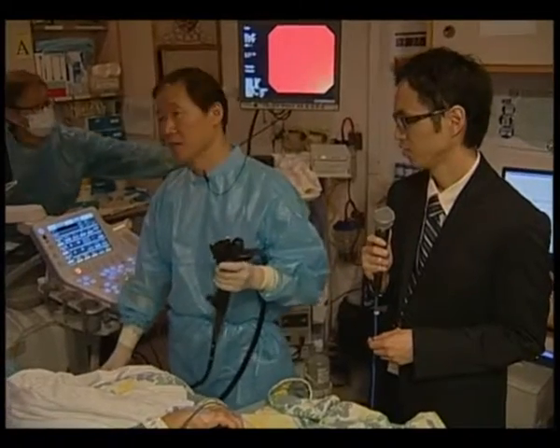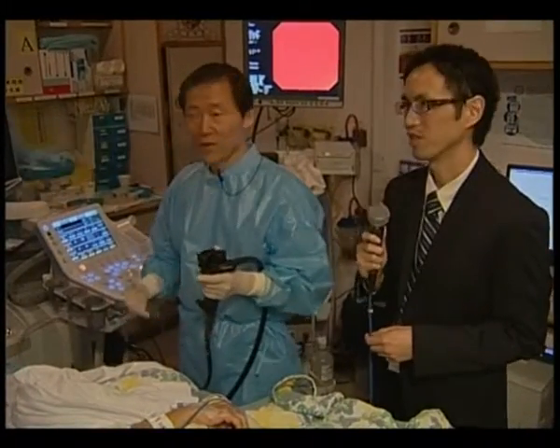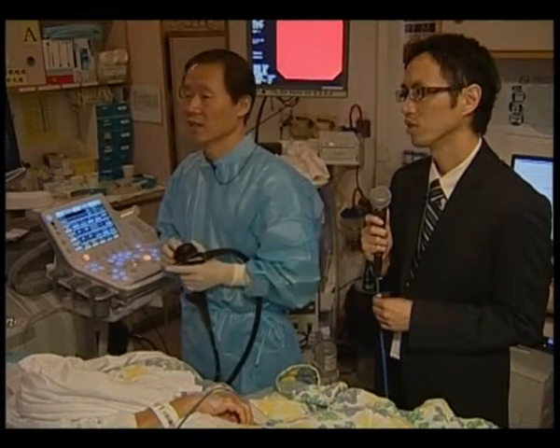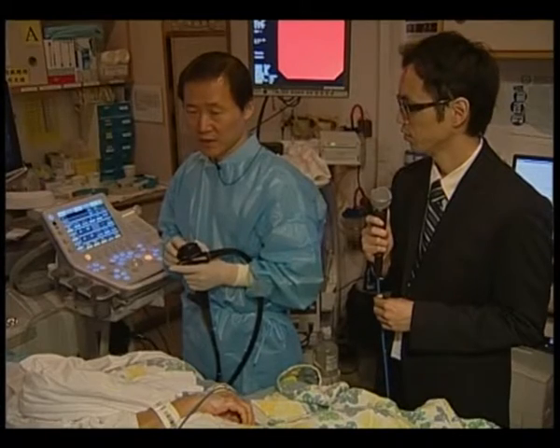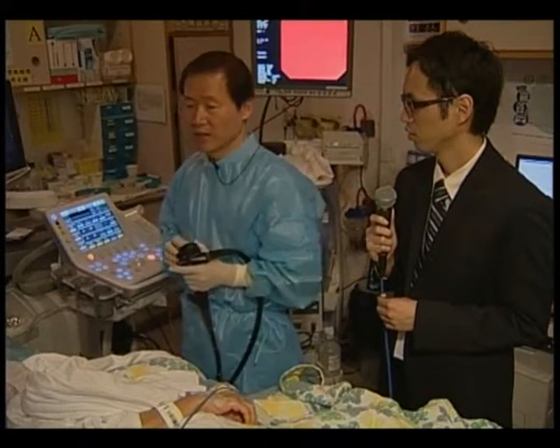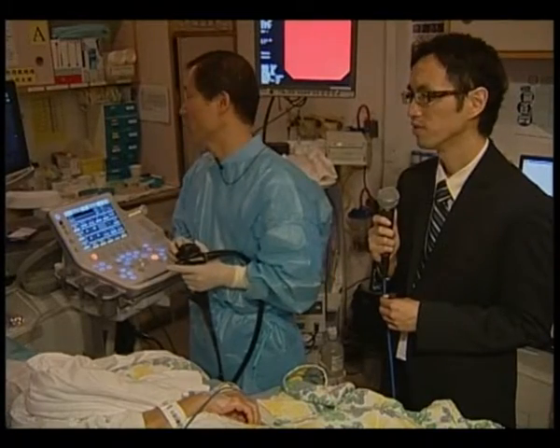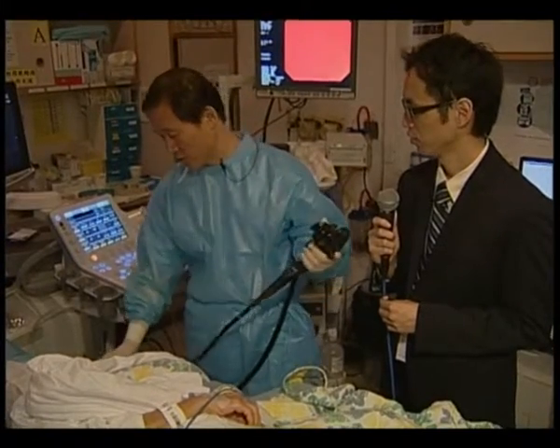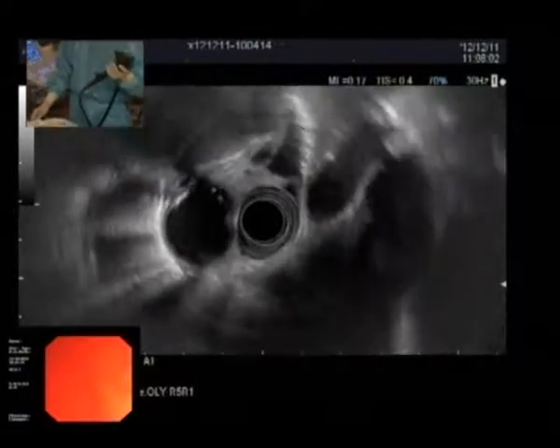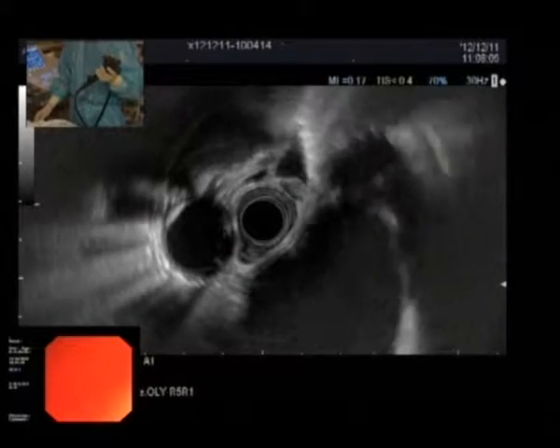This is an 81-year-old female patient showing a bit of bulged pancreas and also showing liver cirrhosis and ascites on CT scan. To evaluate the pancreas and other areas, I already inserted the EUS scope. The tip of the EUS is, at the current moment, in the esophagus here.